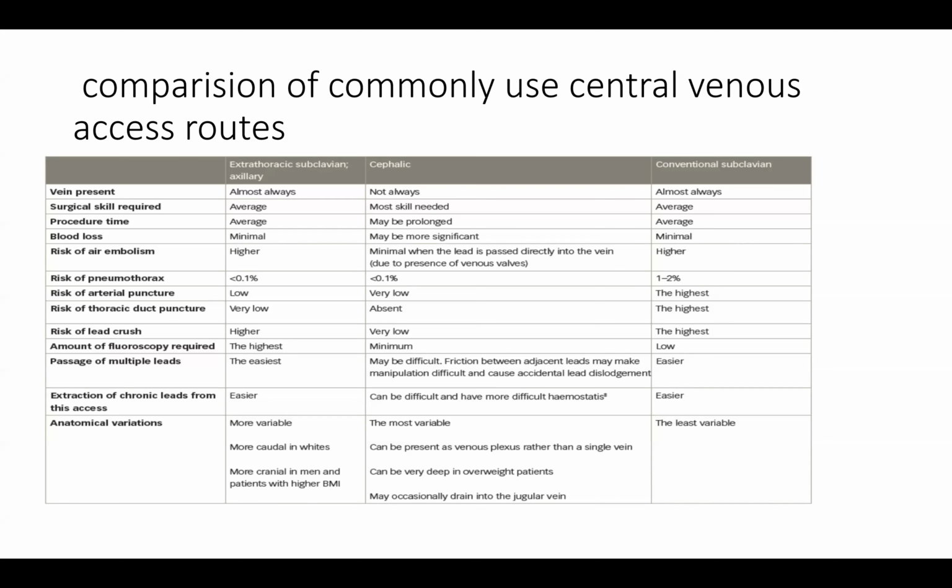So we also look at the risk of lead crush. Yeah, it is highest.